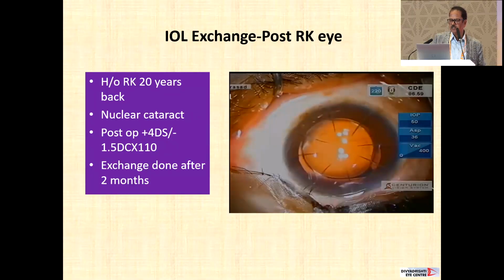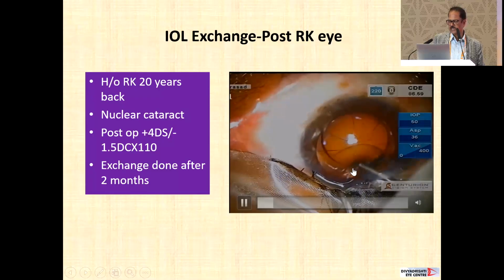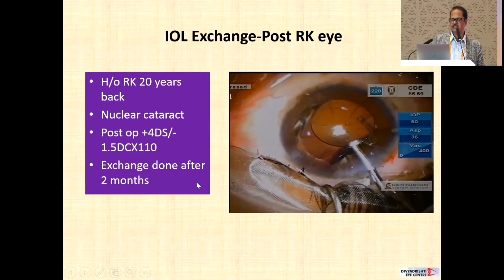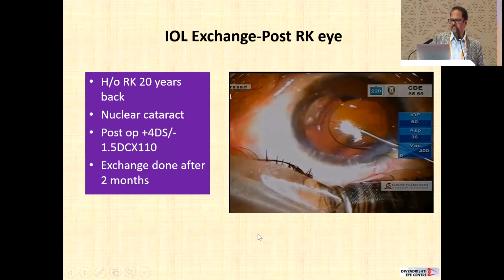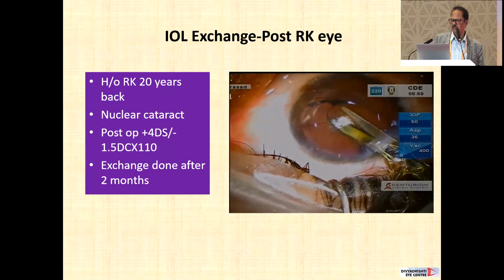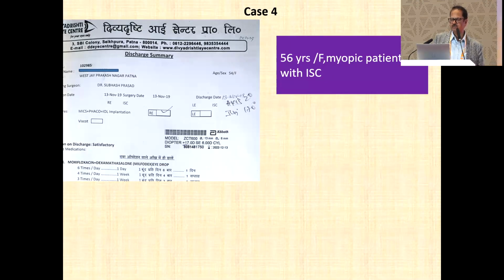This is one small video clip, which is quite old, more than 20 years old. This was my first RK patient who had developed cataract and came to me, and I did not have much idea how to deal with these patients, so I landed with a refractive surprise. After having waited for 2 months, I explanted the lens. Since the number of incisions was less, I could go through the limbal incision, otherwise I could have gone through the sclera. So this was one situation.